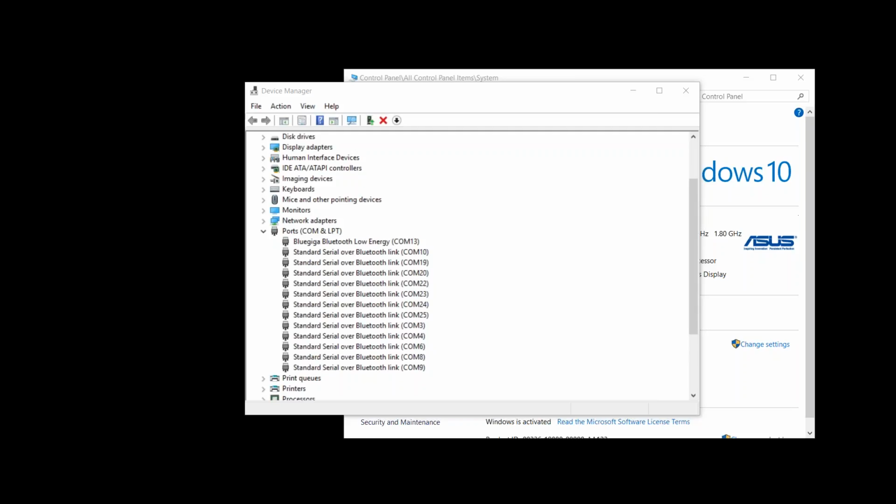That is of course when you give the software out for testing. It usually requires the M-Cell and it requires the dongle for real-time measurements. Of course, you can store data to M-Cell and transfer the data then with the cable and check the offline data. But for real-time measurements, you need the dongle also.